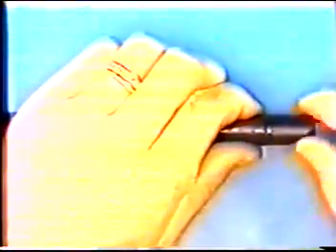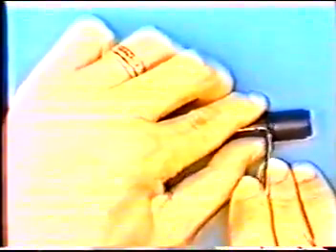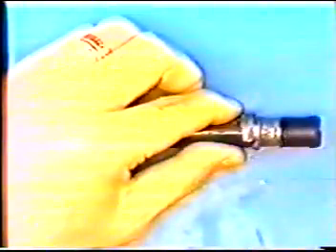Disassembly of distal end assembly unit, DAU, from inserting section. Remove hood. Peel off araldite around angle rubber. Fold back both ends of the rubber to expose soldered portions of the joint.